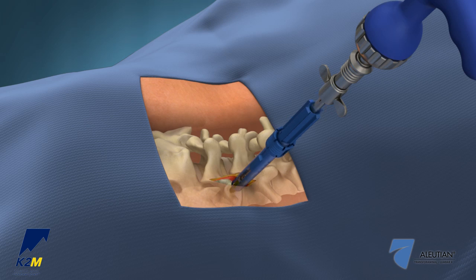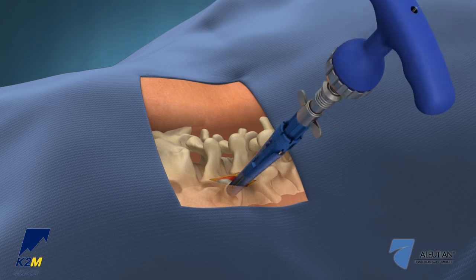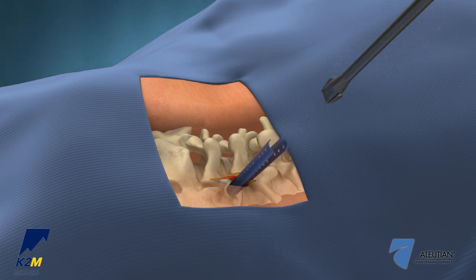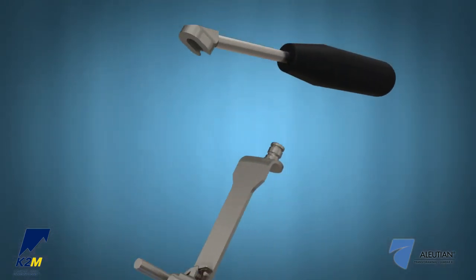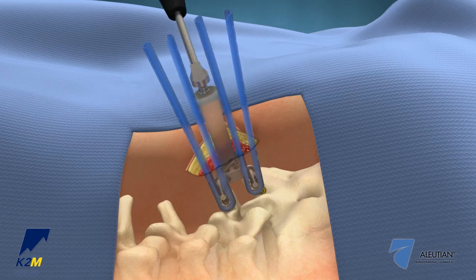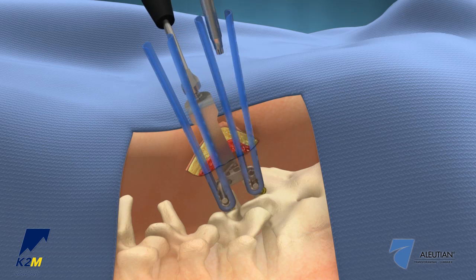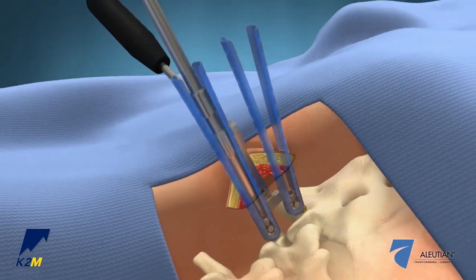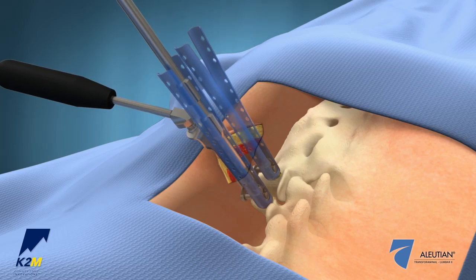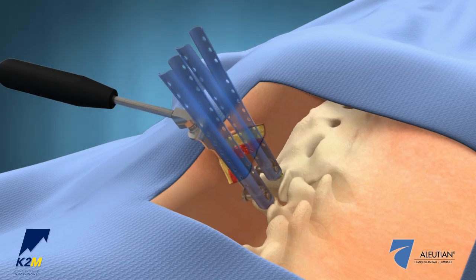Once the appropriate screw has been selected and inserted, use the MI head adjuster to rotate the retractors and screw saddles into a medial-lateral orientation. Attach the blade holder to the retractor-distractor blade and insert the blade into the screw heads. Provisionally tighten the set screws into the screw heads using the provisional screwdriver to secure the retractor-distractor blade to the spine. For optimal access to the disc space, pull the blade handle laterally and tighten one of the set screws to lock it in place.